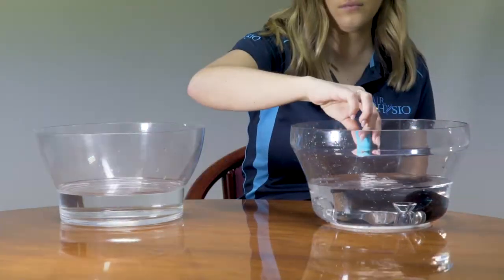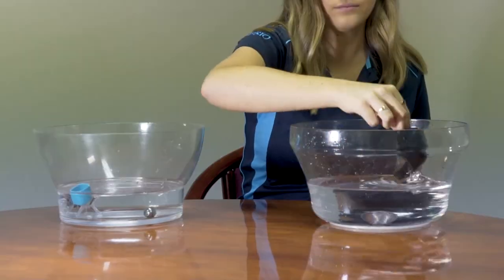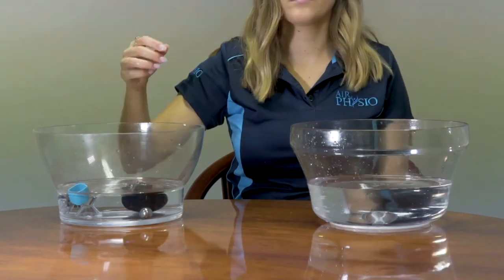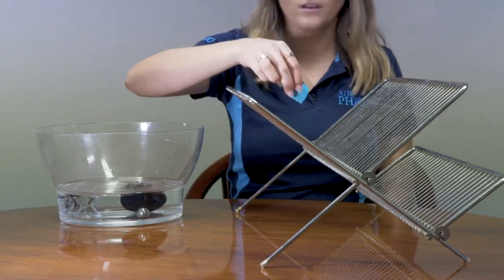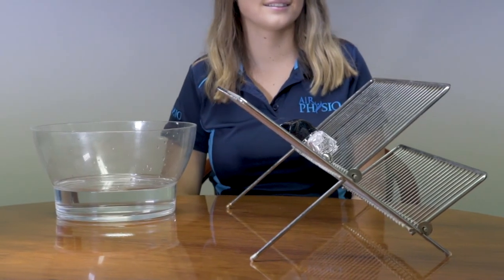Once finished, transfer all the parts back into the distilled water, shaking loose the excess alcohol and water from the parts. Agitate the water and leave for two minutes. The final step is to transfer all the parts onto an air drying rack and allow the parts to air dry before reassembling.